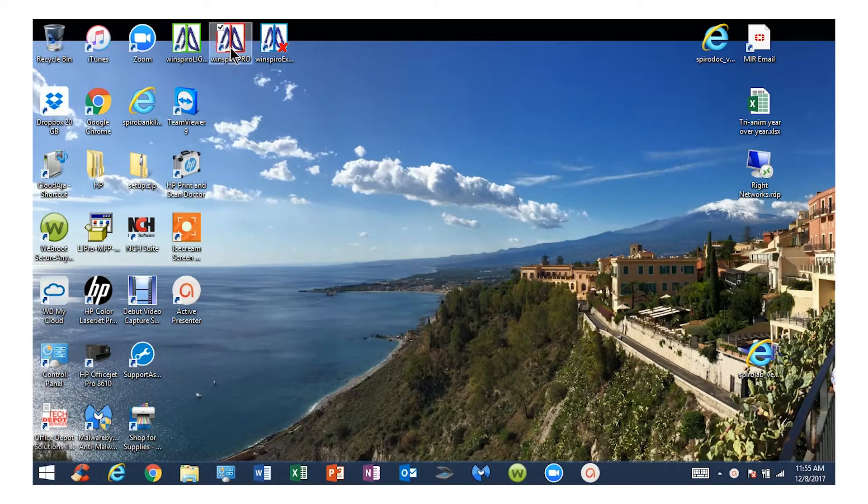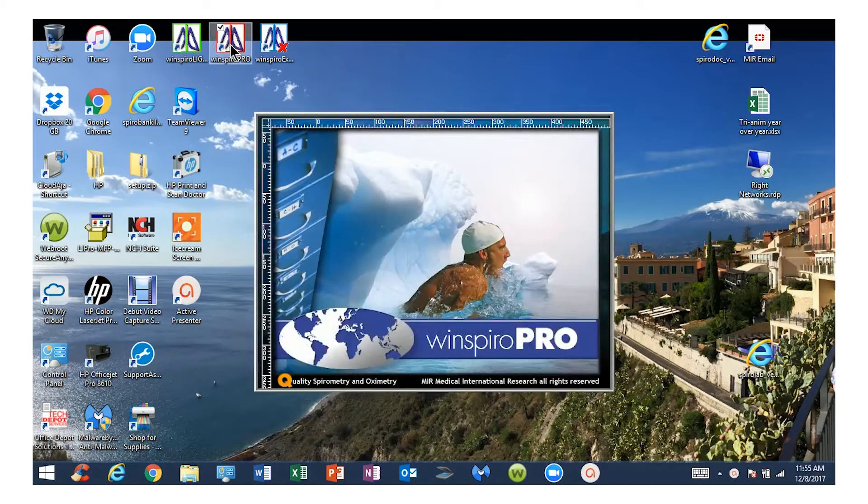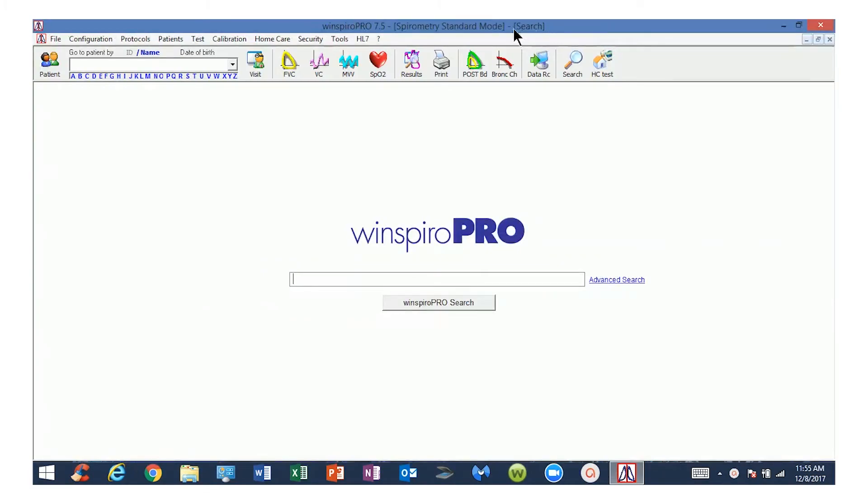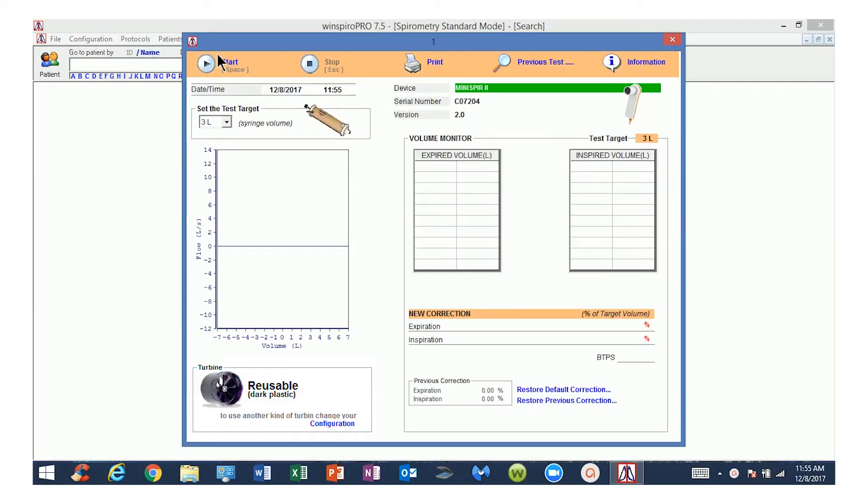Now that you have everything connected, open WinSpyro Pro on your computer. Select the calibration drop-down list at the top of the screen. From the calibration drop-down list, select Perform Calibration Test. This will open the calibration test screen.